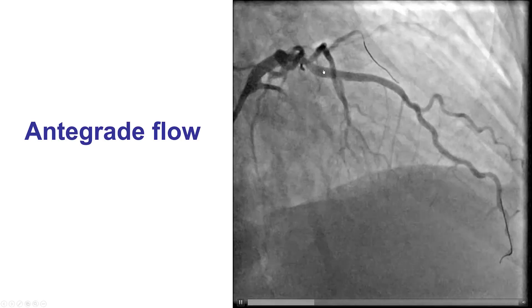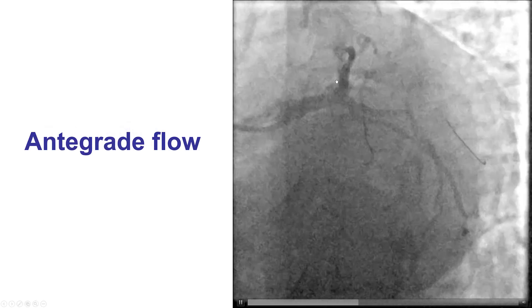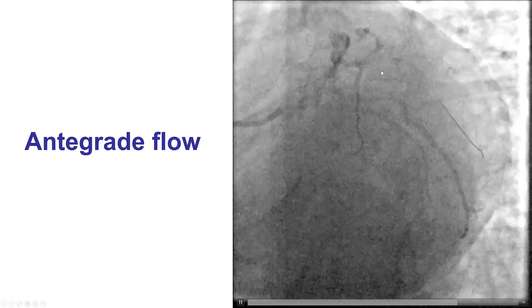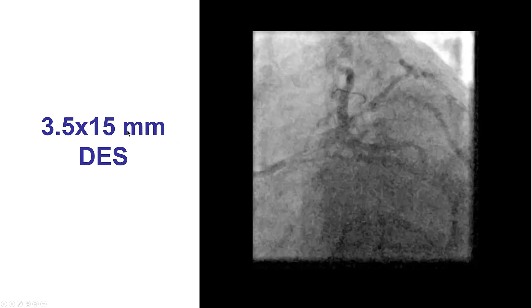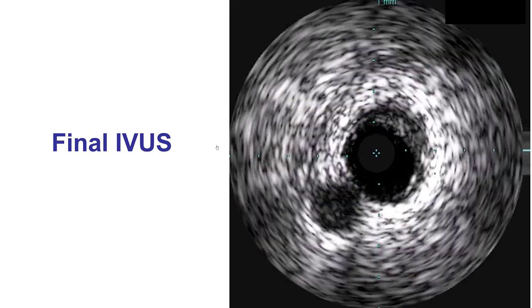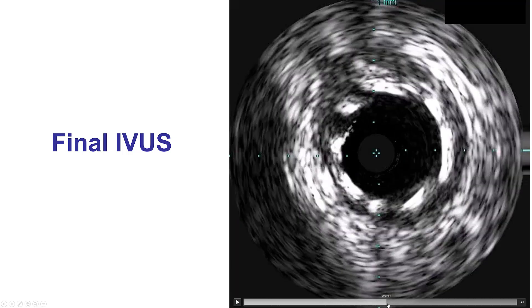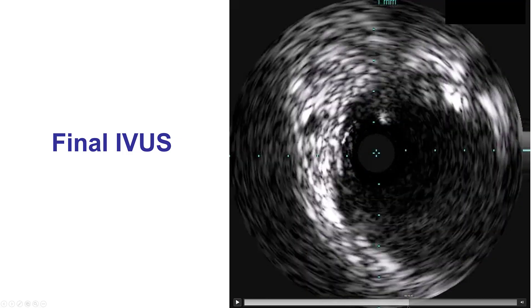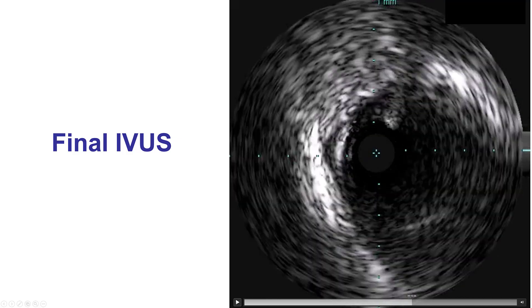After doing that, we were able to restore flow with balloon dilation. This is an early diagonal branch, as we had suspected. The vessel was pre-dilated again and TIMI flow was achieved. Then it was stented with a 3.5 by 15 mm drug-eluting stent that provided a nice result, confirmed with intravascular ultrasound showing that the stent is well expanded and covers the ostium of the vessel without, fortunately, going into the left anterior descending artery.